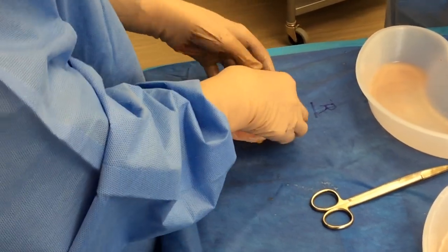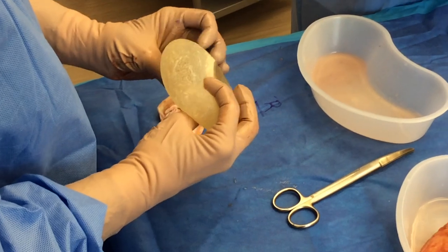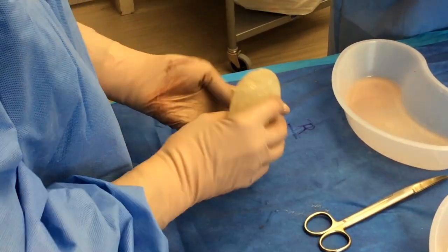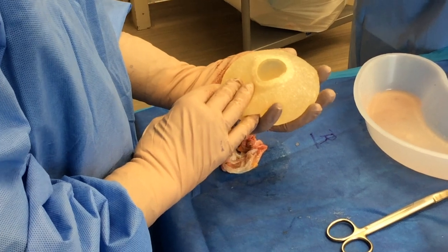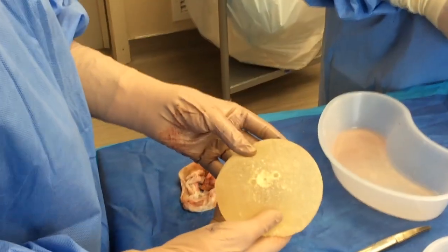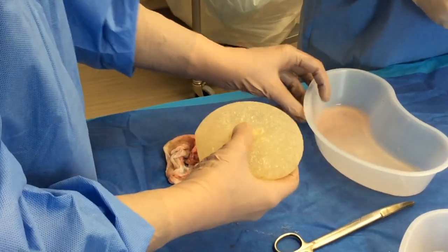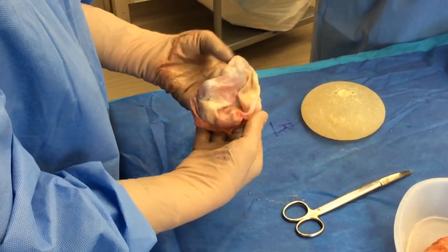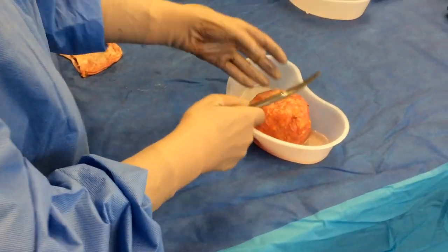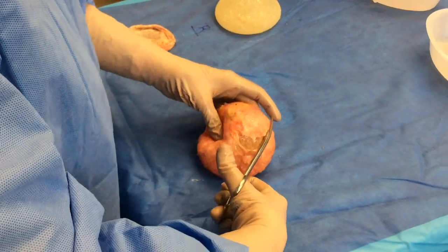On the back table I can just open up this capsule. You can see that she has a textured implant inside. I'm going to sneak this out — all on the back table. Sometimes if I see anything funny or unexpected, I'll take cultures. She has some white residue, so I might take cultures because I've been finding that sometimes I'll find a biofilm or bacteria that will grow out. This is a saline implant, it's textured, and it is intact — it's an Allergan implant. One of the values of an en-bloc dissection is that if there's anything within the capsule, you don't really contaminate the field, which is wonderful.